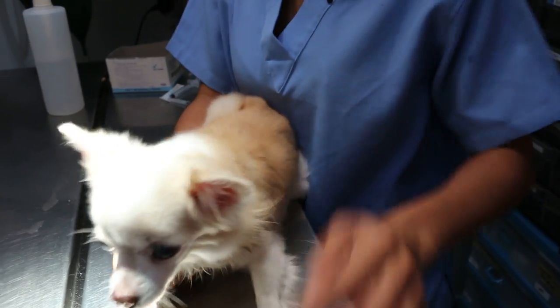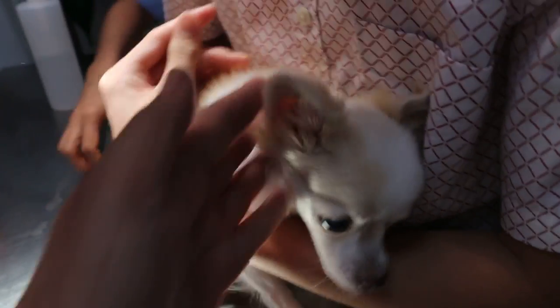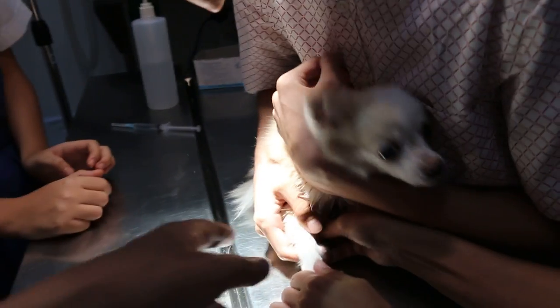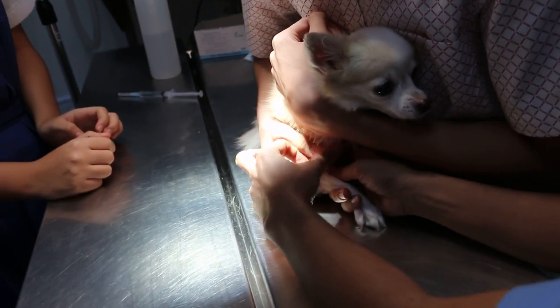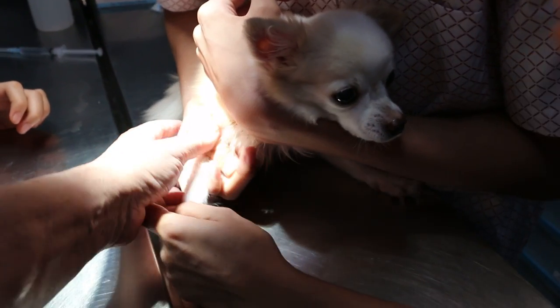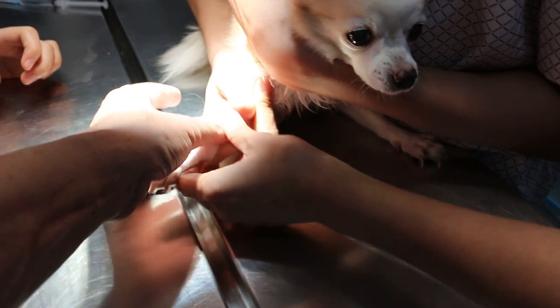Okay, come. Take over — you have the strength. The best is to shave a bit because unless you're very experienced, hold close to your body. Then the best is to push. The finger — then you need to... press on the vein so the vein comes out. Twist. Twist a bit the skin on your right. Like that — the skin twists a bit outwards. So there's a vein here. Don't use this one.